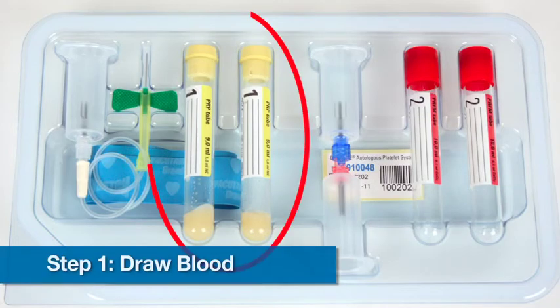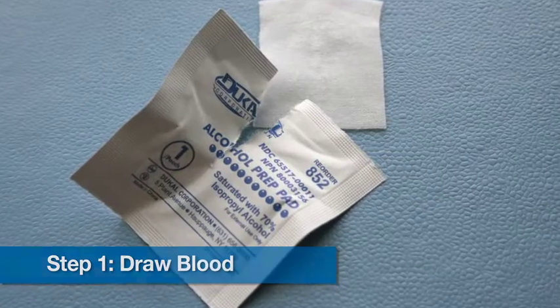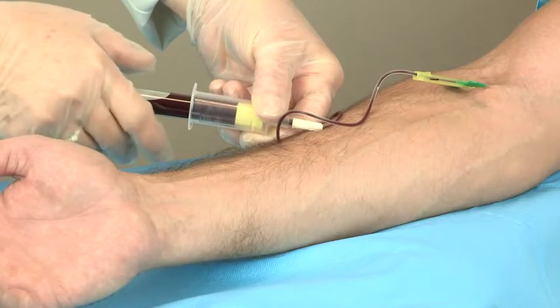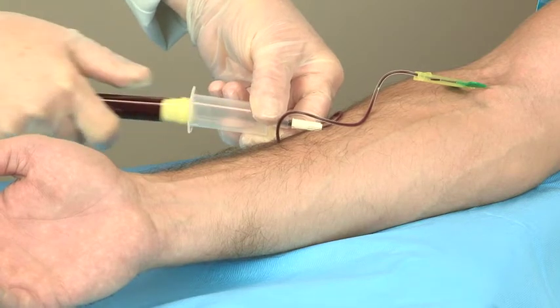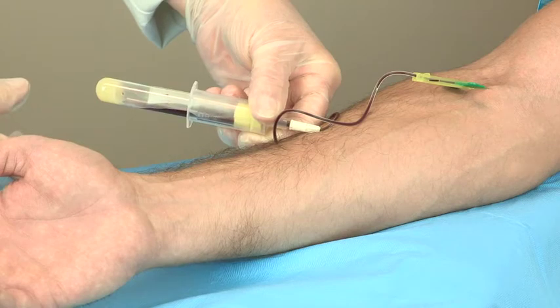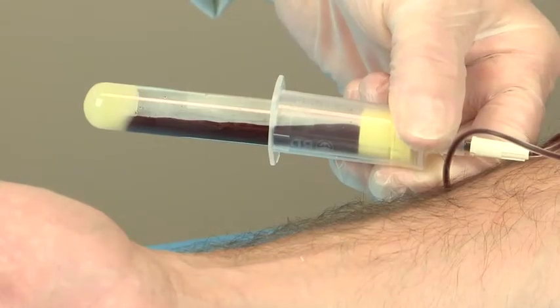Remove both yellow PRP tubes from tray. Wipe tops with clean alcohol swab prior to blood draw. Following accepted blood collection guidelines, draw 9 cc's of patient blood into each yellow PRP tube through a non-heparinized line. To maintain vacuum, leave a 1/4 inch gap between yellow stopper and collection tube.